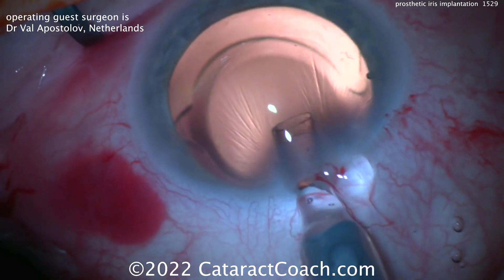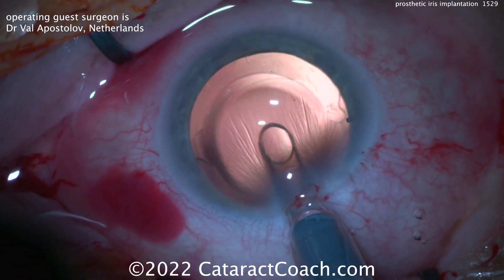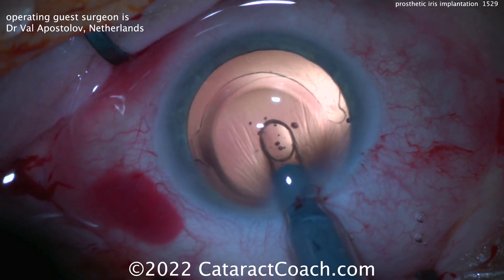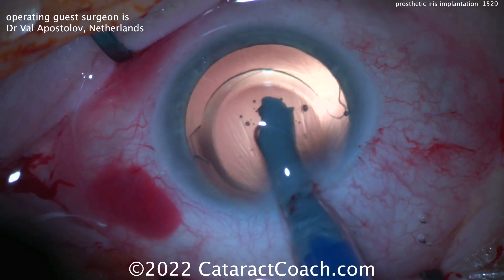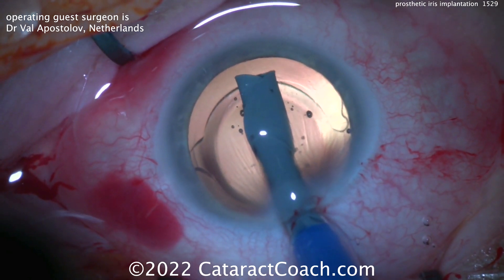I like how Dr. Apostolov has turned on just the red reflex light to emphasize that red reflex. Now inserting this device — if you use Trypan Blue Dye, be careful, it may make the capsule a little less elastic. In this case you need a lot of stretching on that capsule to get this thing to fit. Here is the device coming inside the eye, and you can also use a second instrument to help guide it into position.